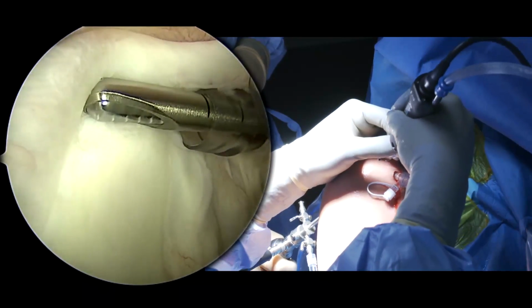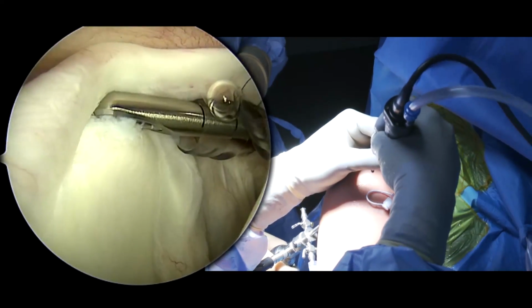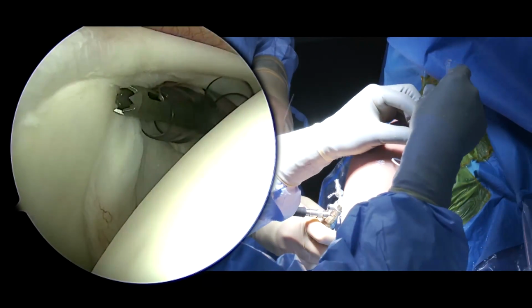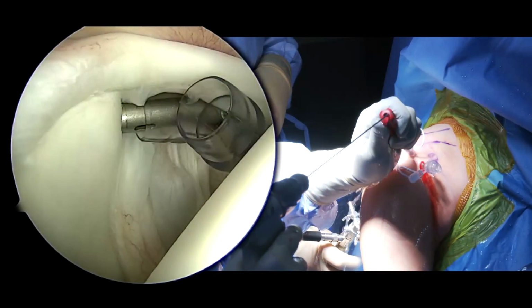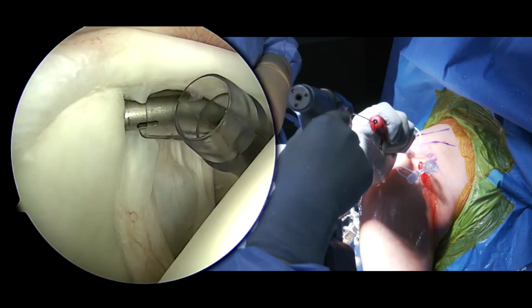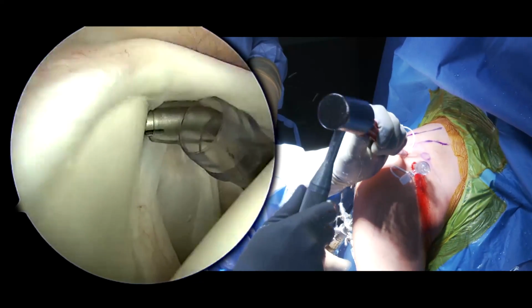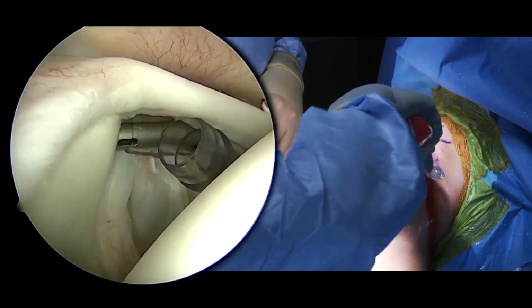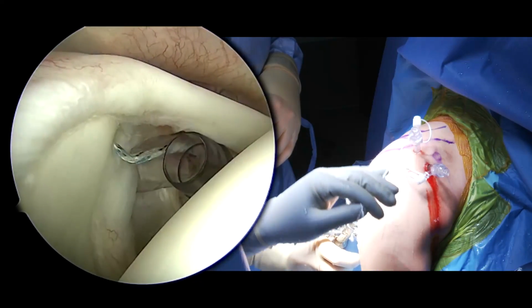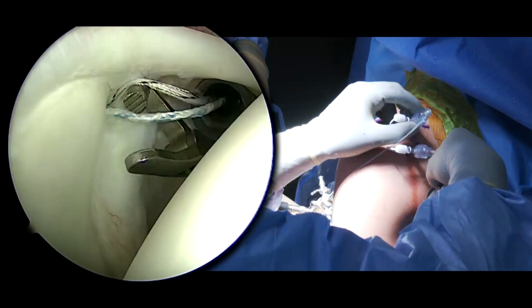With an oscillating shaver on burr mode, the superior aspect of the glenoid is prepared. A curved drill guide is placed through the high anterior rotator interval portal and placed just anterior to the biceps root. A single all-suture anchor is then placed, first manually by hand and then finished by impacting with a mallet. The anchor is then seated by manually pulling on it to fully secure it.